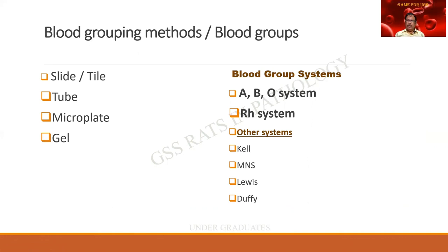What are the different blood groups? And immediately the student answers slide, tube method, etc. These are the blood grouping methods. The blood grouping methods are either the slide, otherwise called the tile method.